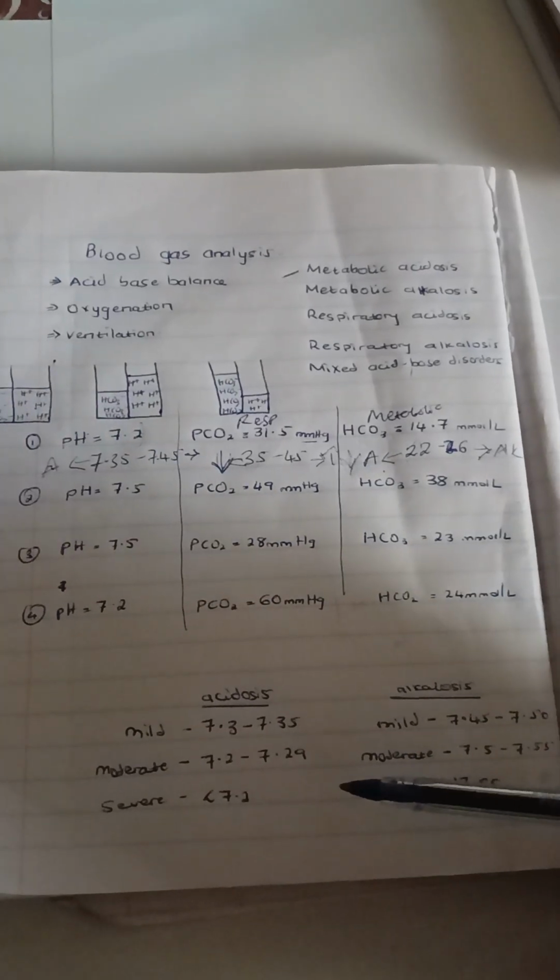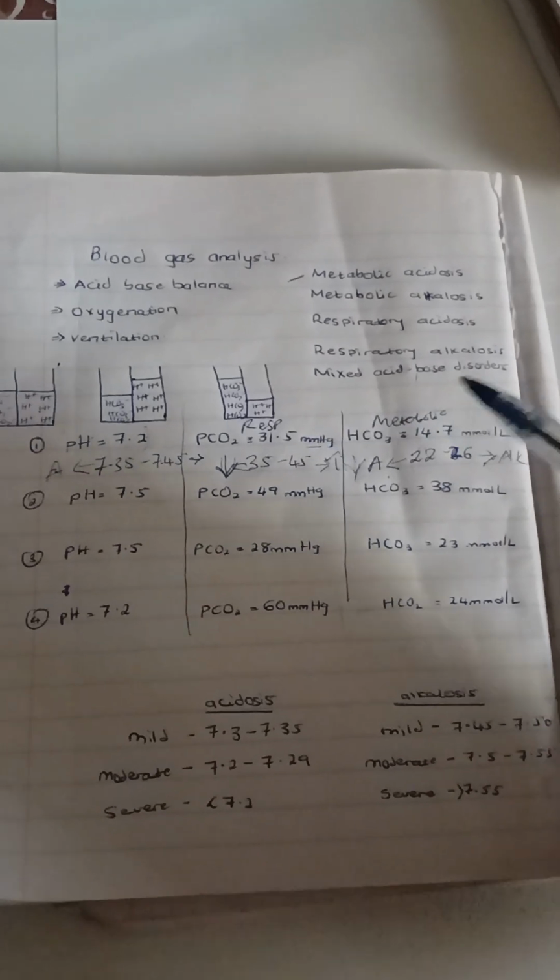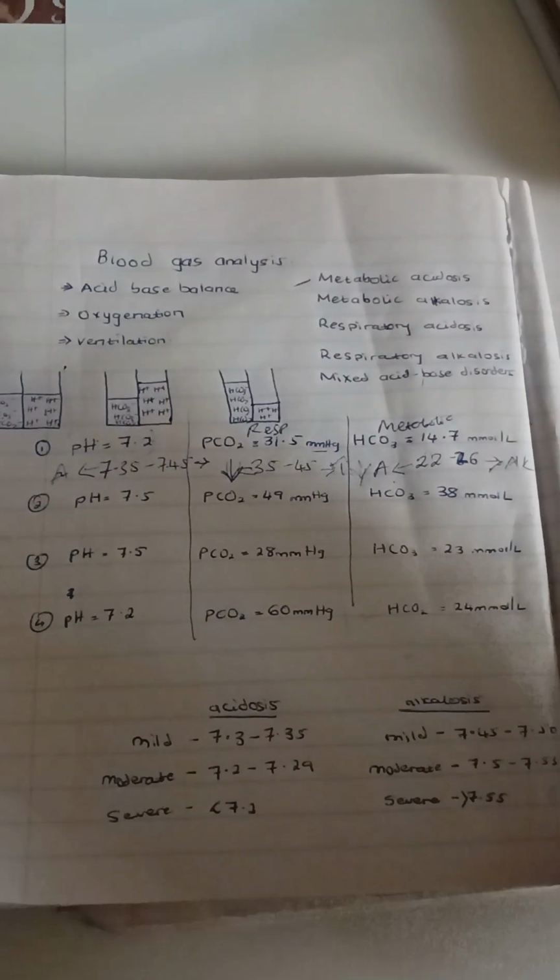So in this video, we have learned how to interpret a BGA to be able to identify the primary acid-base disorder. Next, we can talk about compensatory mechanisms, then mixed acid-base disorders, followed by the oxygenation status and the ventilator status of the patient. Thank you.